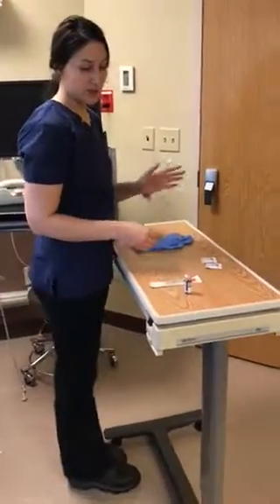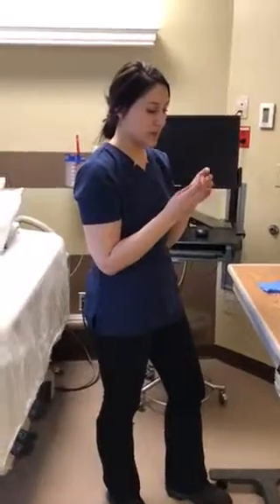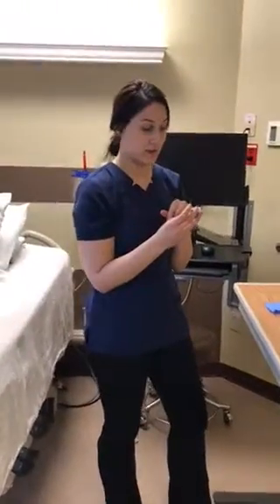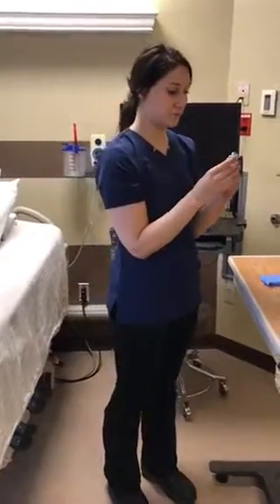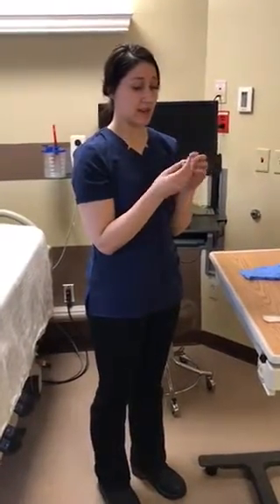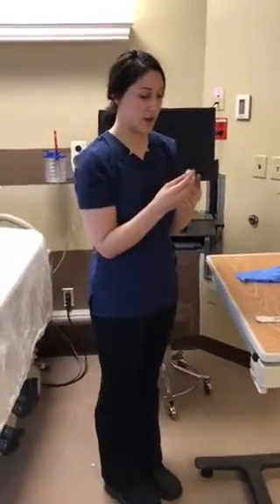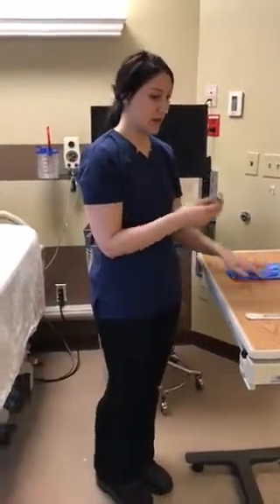The next thing I'm going to do is withdraw my medication from the dispenser. This is a multi-dose vial, and I see that it has been opened. The expiration date is 4/27, so it is within the time. The date, she opened it today. It is Humulin U100 R. There are no particulates or broken glass. It does have today's date as the date opened and the initials of the last nurse that gave it. So everything looks good with that vial.